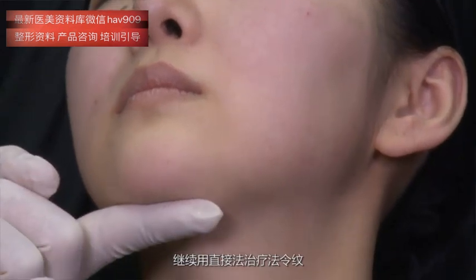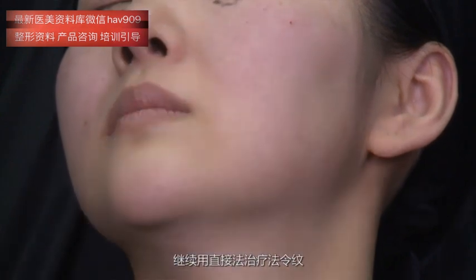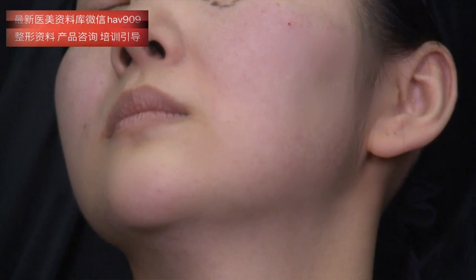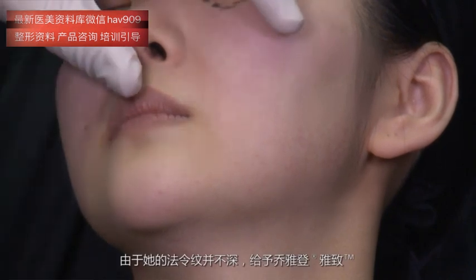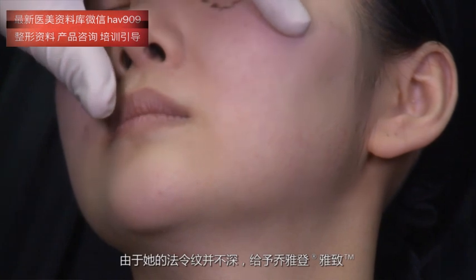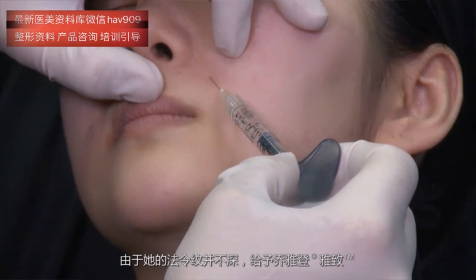Proceed to the treatment of the nasolabial fold with the direct approach using Juvederm Ultra, because her nasolabial fold is not deep.